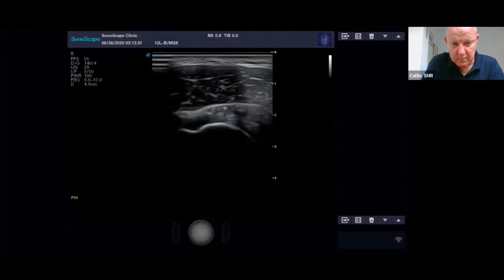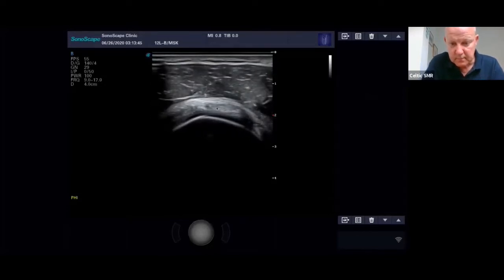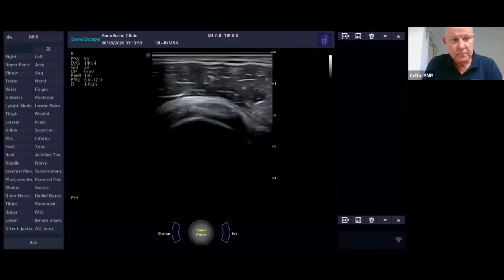So I'll get the pointer out. This is what I'm talking about here. This little red thing here, that's your focus. And this is the supraspinatus. Here we've got the skin, we've got the deltoid muscle. And actually what I can do is I'll freeze this.